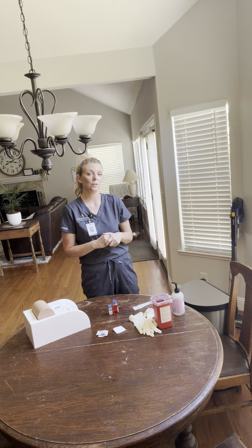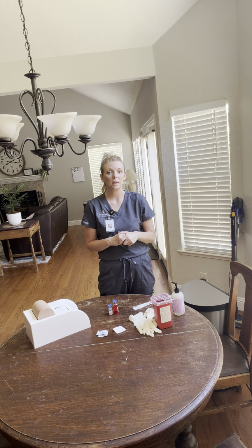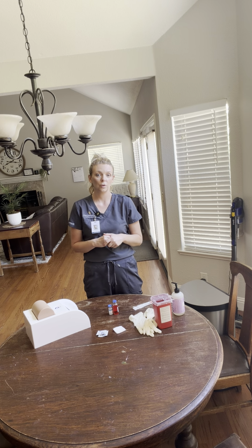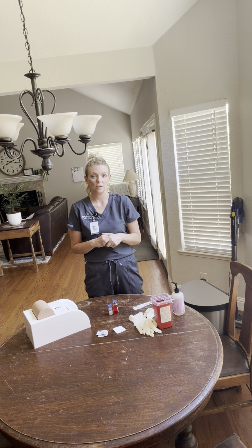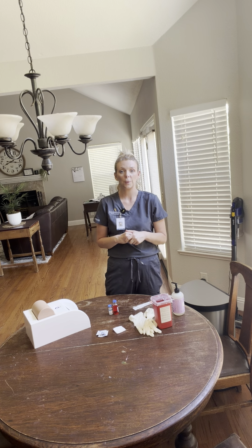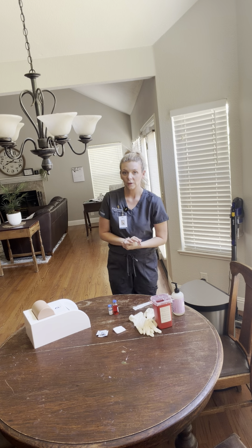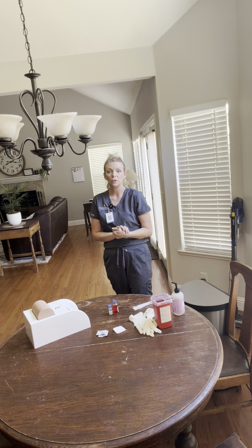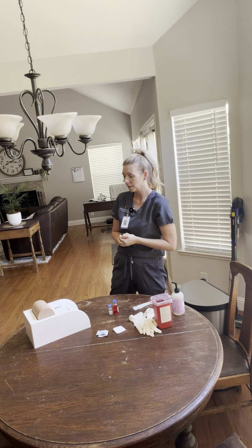After reviewing the physician's orders, the physician has requested 4 units of regular insulin and 8 units of NPH to be given about 30 minutes before breakfast. So that's what we're going to do. So I'm gathering my supplies and I'm going to go introduce myself to my patient and knock on the door, and they invite me to come in.